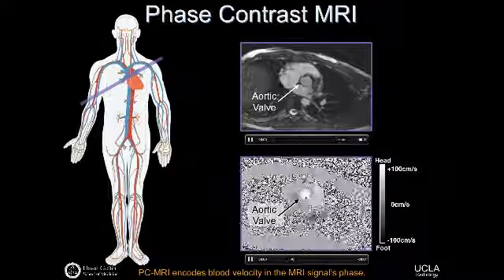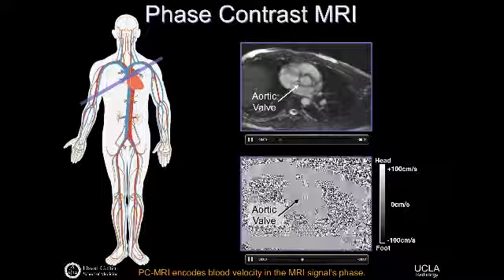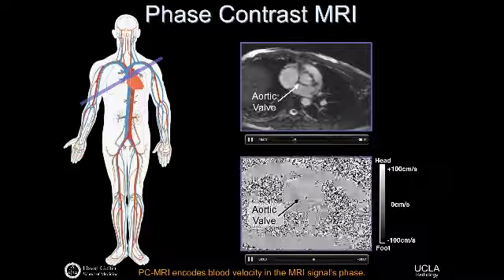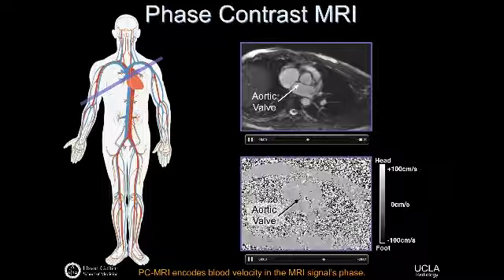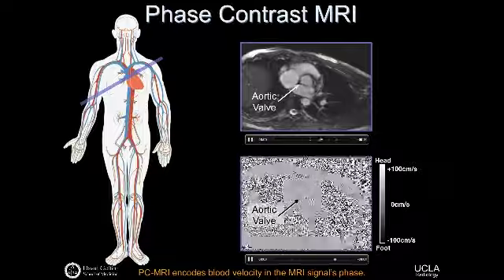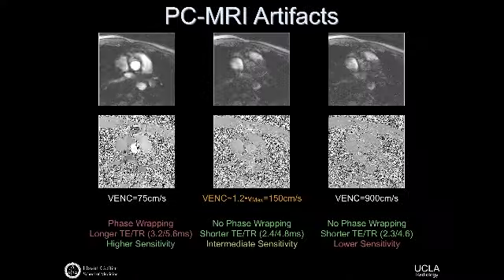So diagnostically, it can be useful to measure how much blood or how fast blood is flowing between locations. And so here, just a reminder, or pointing out rather, that MR can use gradients again to encode the velocity of flowing blood, and can be useful for cardiovascular applications.